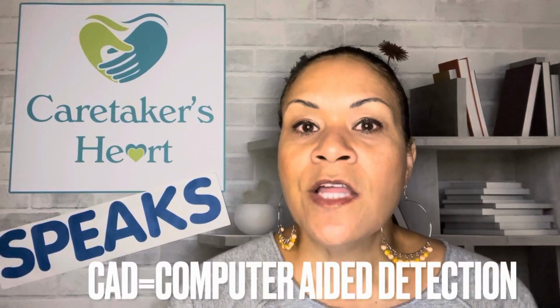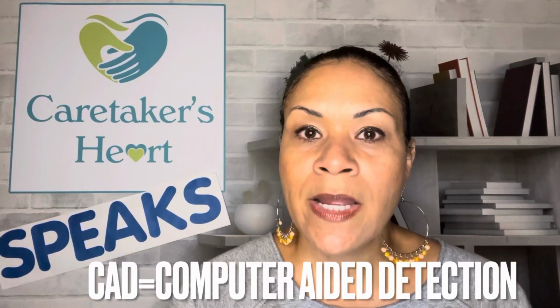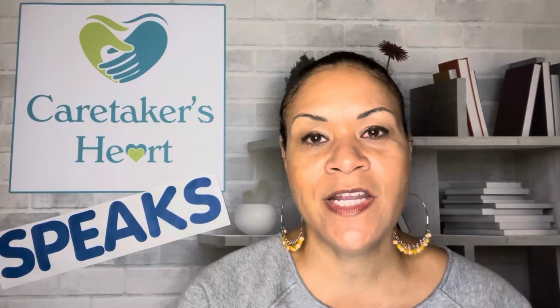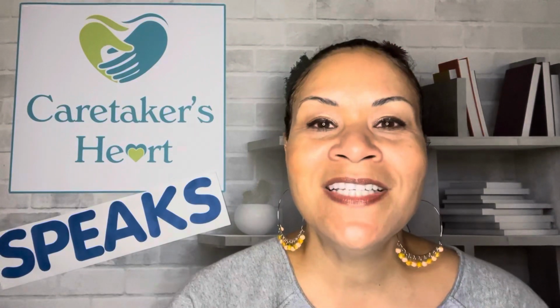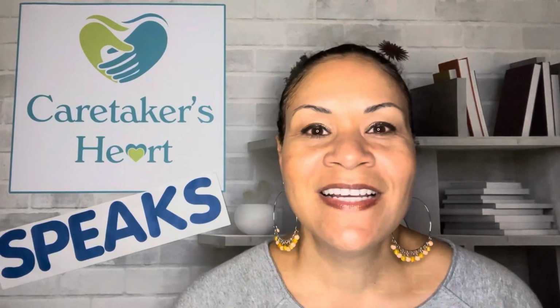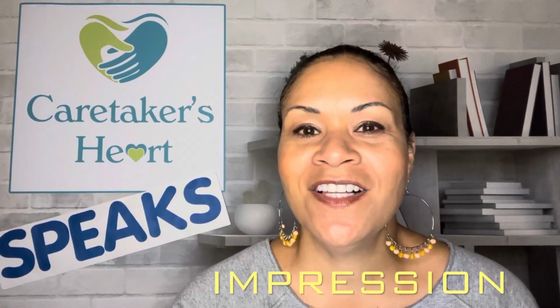And lastly, the radiologist may mention that the mammograms were actually read by computer-aided detection. And this means that your mammogram was analyzed by a computer that actually picked out areas that look suspicious so that the radiologist may go back and look at those areas more closely. So that means that your mammograms are not only being read by a human, but also by a computer as well.